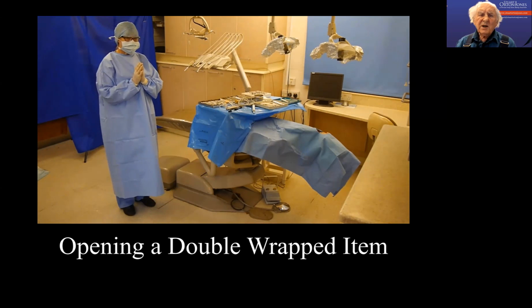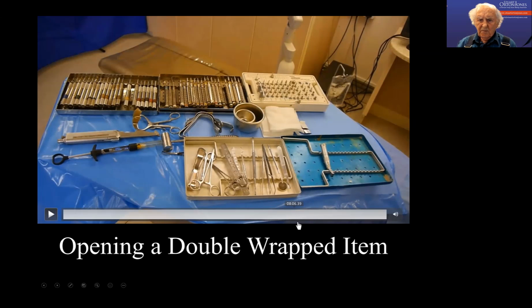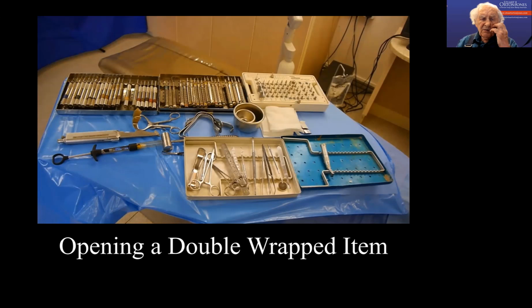Then she's going to stand waiting like this. So that's the setup for some implant placement.